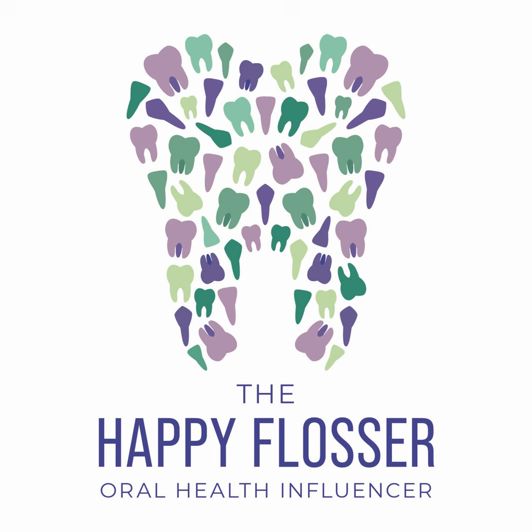Now, there are some challenges, and they seem to always reveal themselves when we're taking radiographs. There's space limitations in there. Some people have a shallow palate. Some people have tori. Bilateral mandibular tori are the nemesis for taking a really quality image on those mandibular teeth.